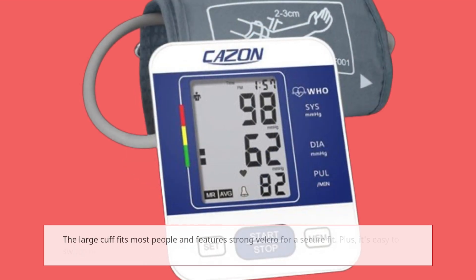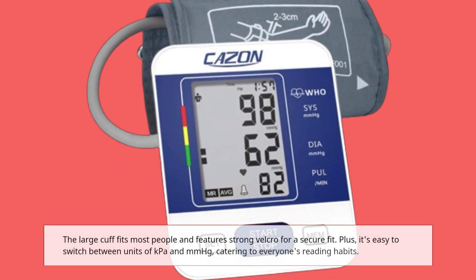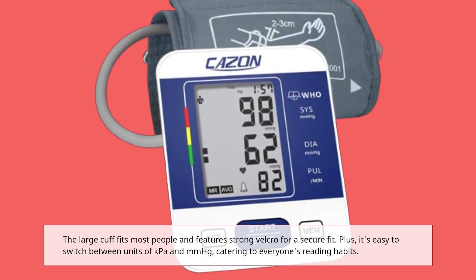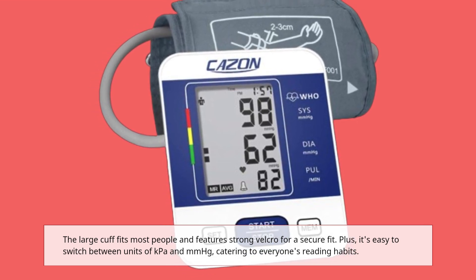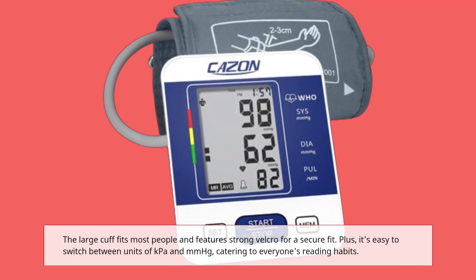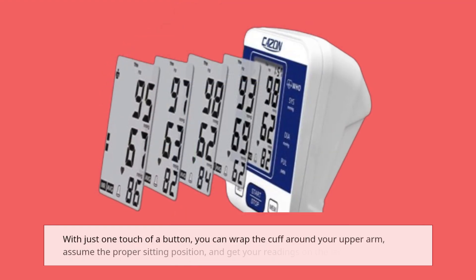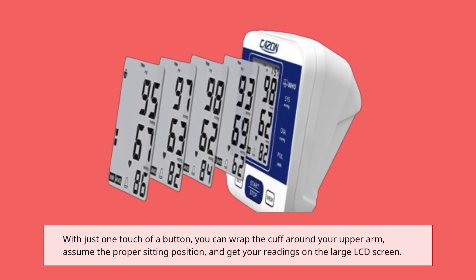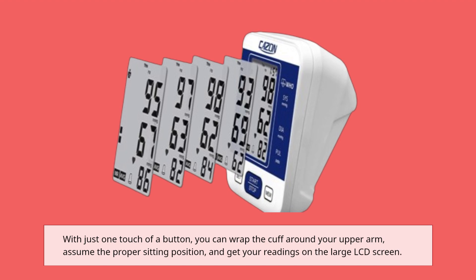The large cuff fits most people and features strong Velcro for a secure fit. Plus, it's easy to switch between units of KPA and MMHG, catering to everyone's reading habits. With just one touch of a button, you can wrap the cuff around your upper arm, assume the proper sitting position, and get your readings on the large LCD screen.